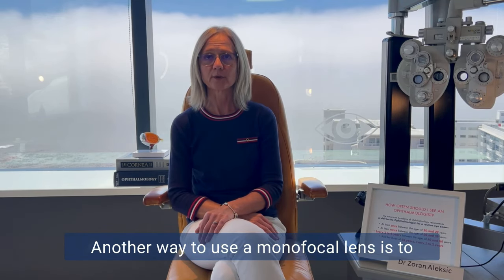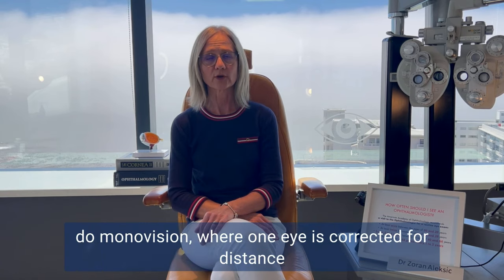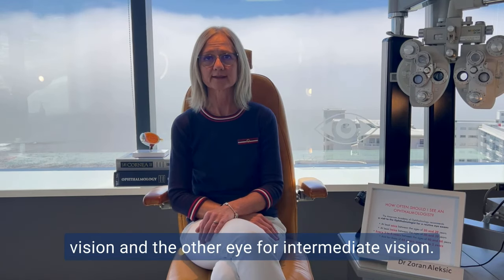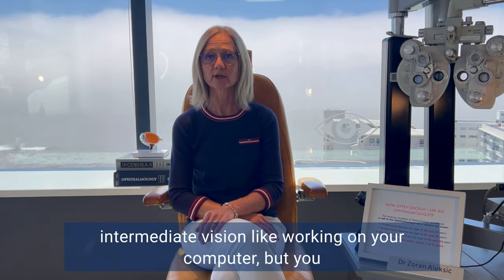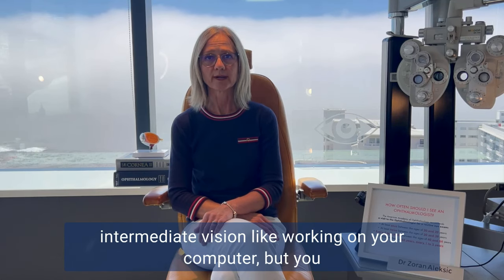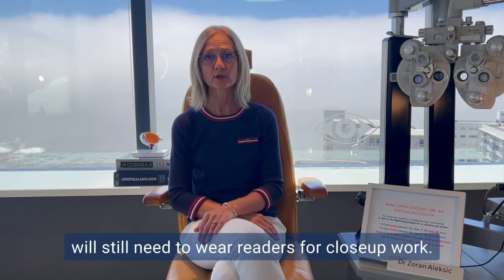Another way to use a monofocal lens is to do monovision, where one eye is corrected for distance vision and the other eye for intermediate vision. This will make you less dependent on glasses for intermediate vision, like working on your computer, but you will still need to wear readers for close-up work.